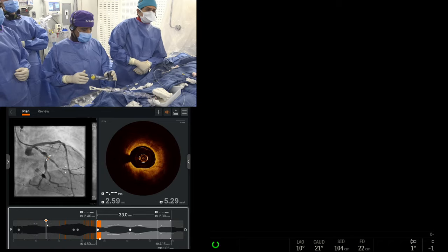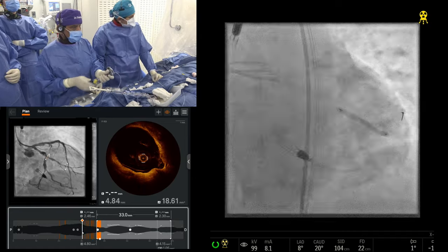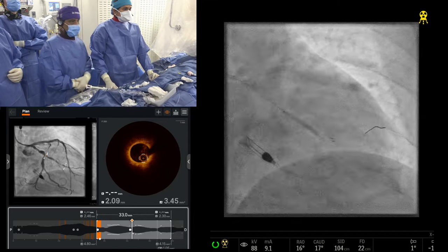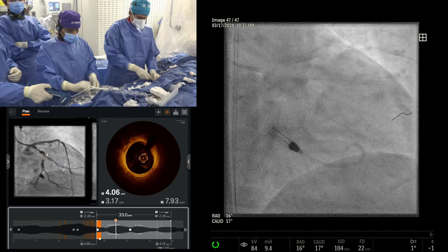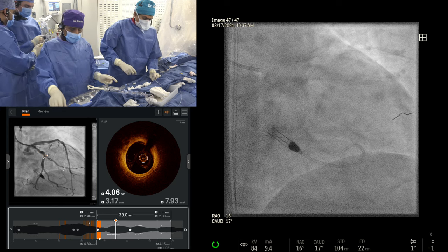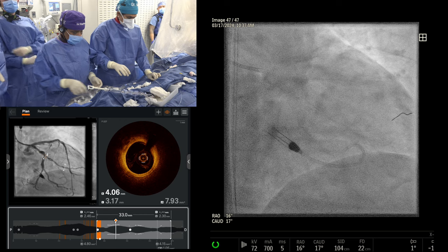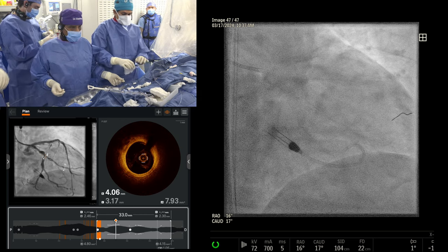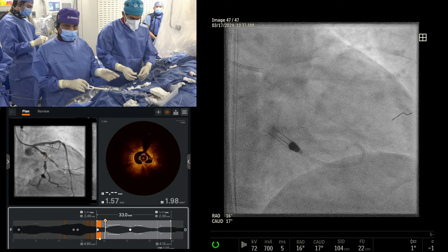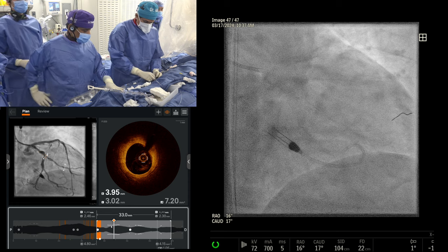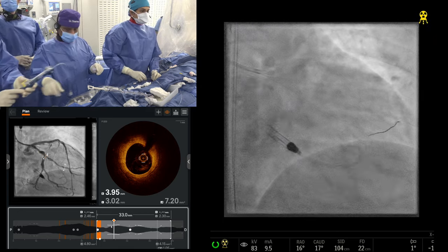There is slight calcium in the proximal circumflex at the ostial OM1, but not thick — very focal and not meeting the rule of three. Small vessels and long lesions are where imaging is really important — that's where you really have to optimize the minimal stent area. A 4.0 vessel — you might not change outcomes much. But diffuse complex disease, calcified lesions, small vessels — that's where you can really make a difference.